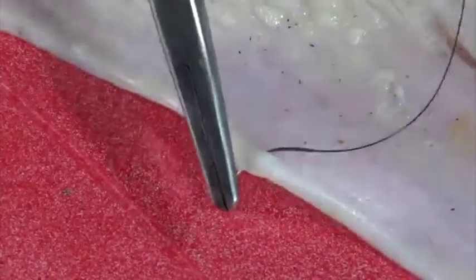Repairing skin tears in the elderly can be difficult because of the cheese wire effect, where the skin is so fragile that ordinary suture simply tears through whenever you apply tension to it. If steristrips and tissue glue alone aren't enough, there are a few hybrid methods that can improve your chances of success.